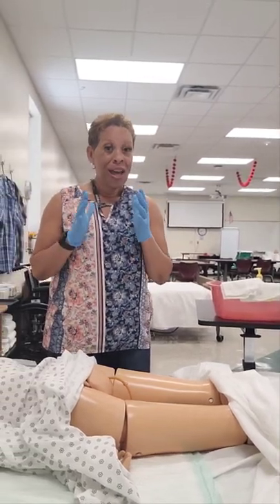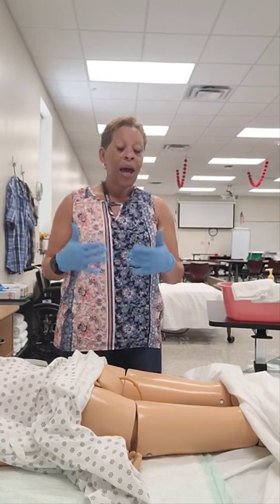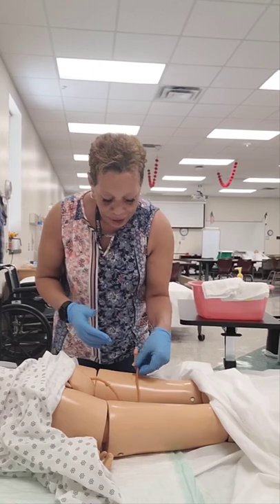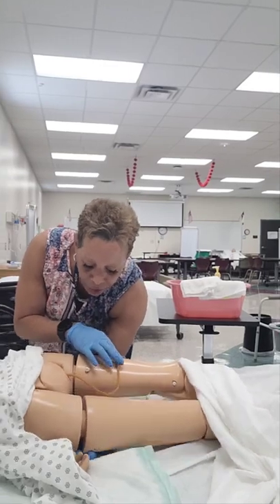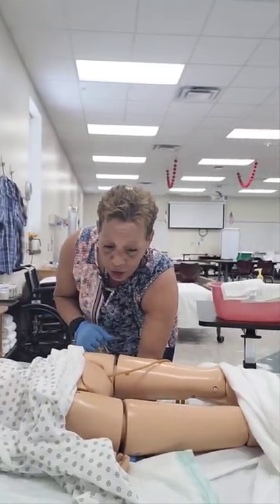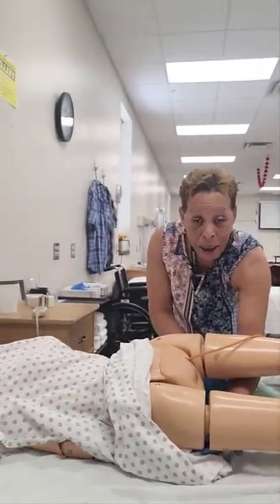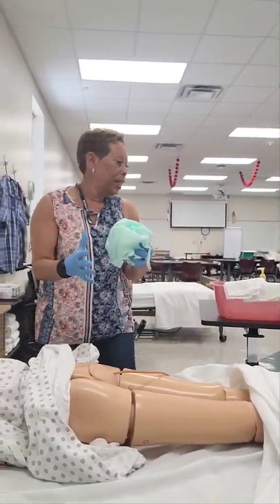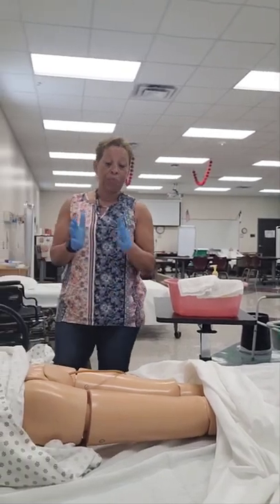The next step — the most commonly forgotten step — is removal of the linen protector. I remove it the same way I placed it. Mrs. Jones, on the count of three I'm going to raise your hips. I place the catheter aside so I won't snag it, place my arms underneath your thighs, and on the count of three — one, two, three — as I raise the hips I roll the chucks away from me and pull it toward me simultaneously, making sure it doesn't contact my clothing, then immediately dispose of it into the waste bin.